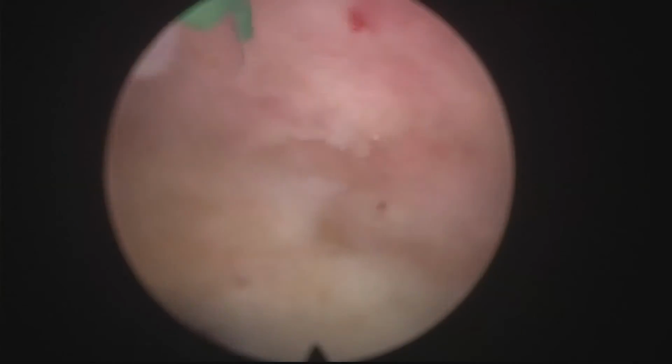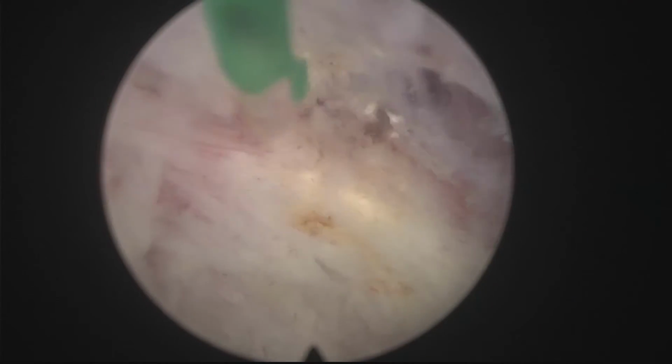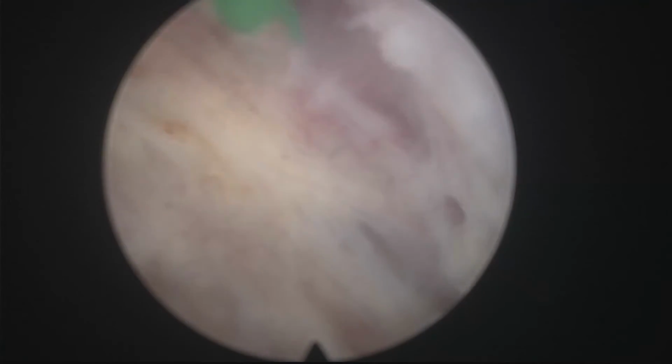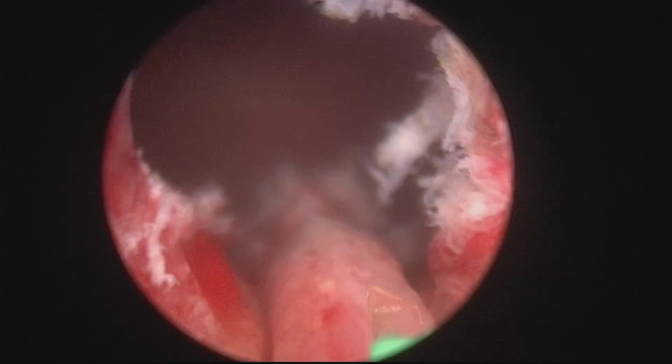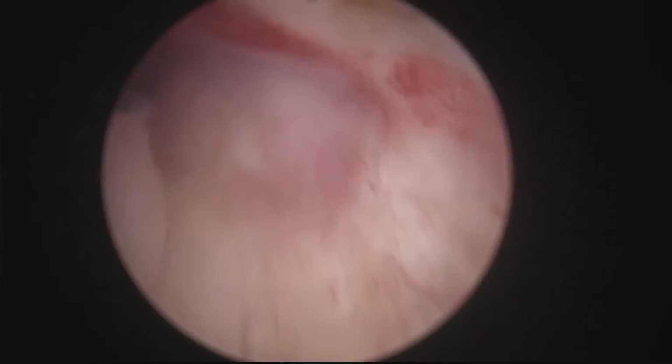The next thing I'm going to do is try to get in with a biopsy device to take biopsies from the mucosa of the diverticulum. We want to see if these changes we have seen in the diverticulum... and that's the adenoma. You can see that it's a donut, a circumferential piece. So we have managed to do an en bloc enucleation of the residual tissue after TURP.